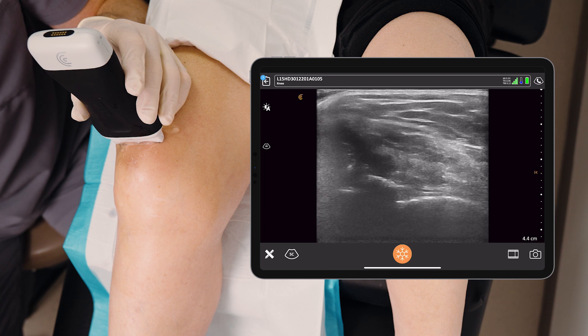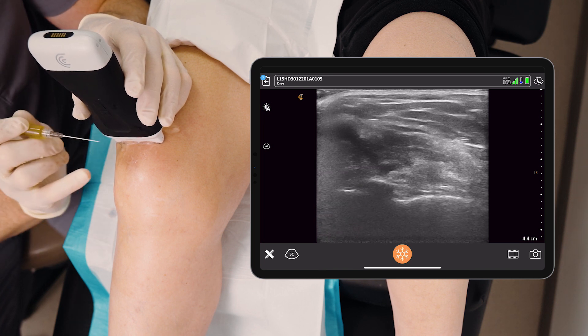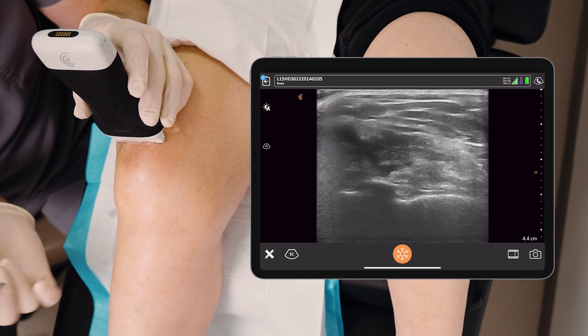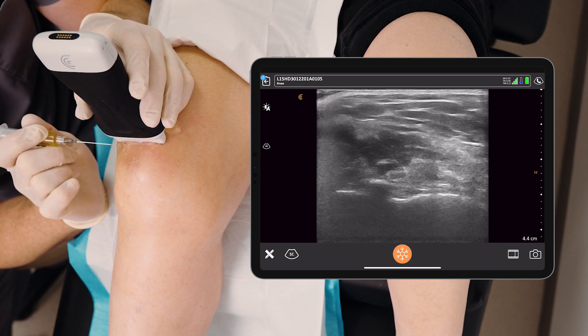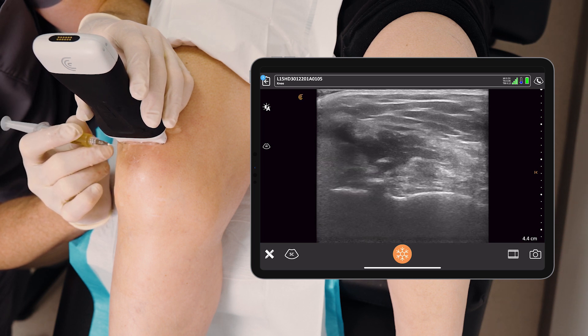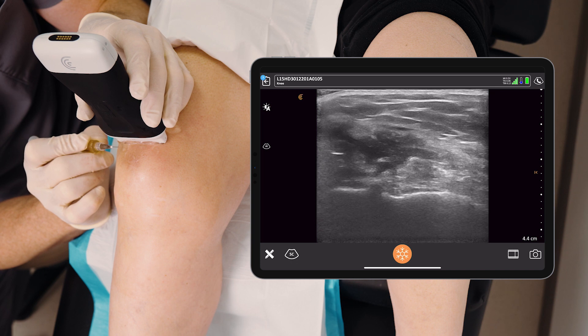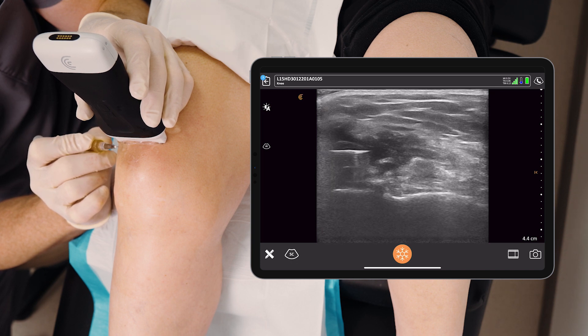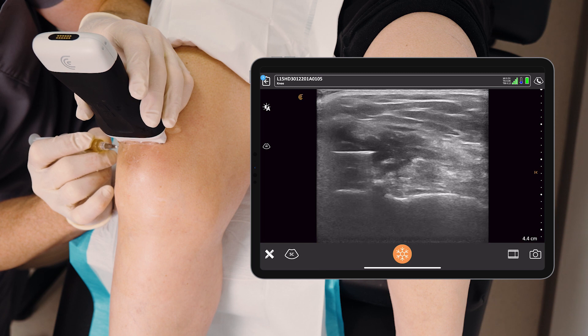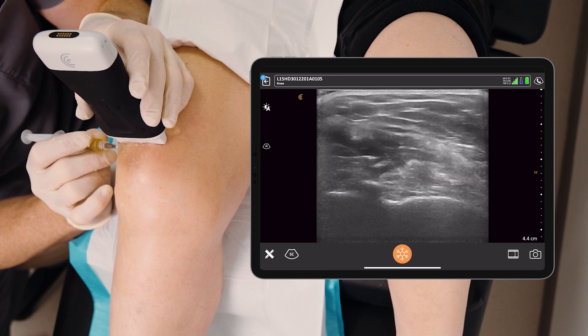Here we are — we're going to come from the left-hand side of the screen into that black fluid pocket. I brace everything; I've got my sterile gloves on and my sterile drape at the proximal end. Here we go. You can see the needle coming from the left. If I were to inject it right here it would be inside the pre-femoral fat — I don't want that. If I pass the needle just that tiny bit further, this is actually inside the fluid of the knee joint.